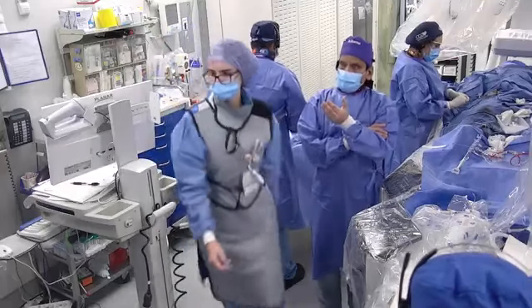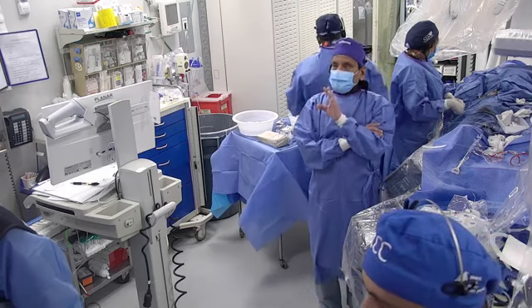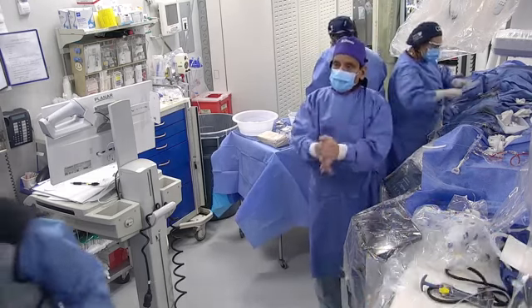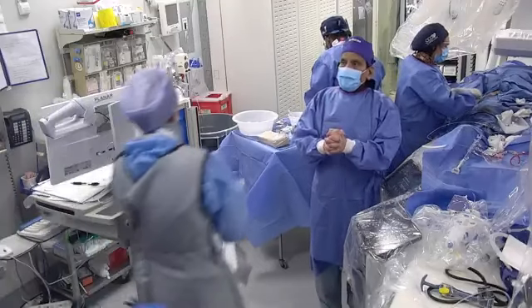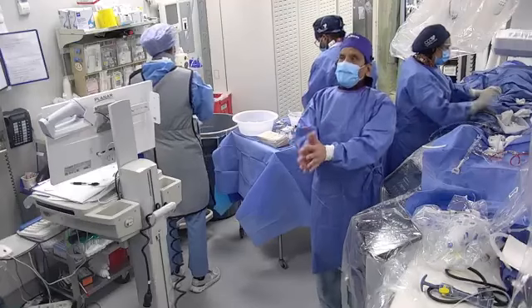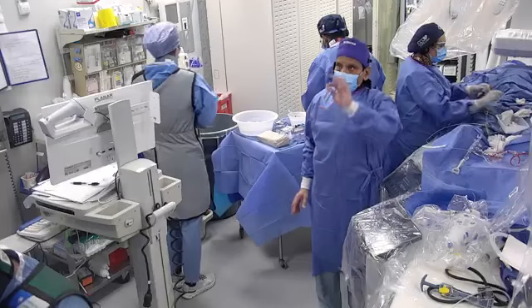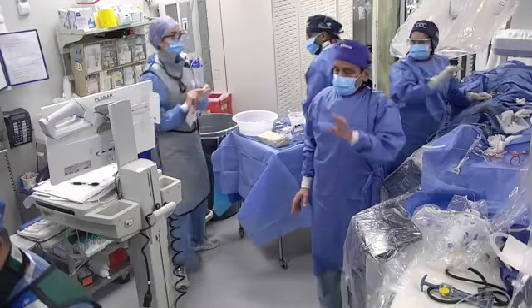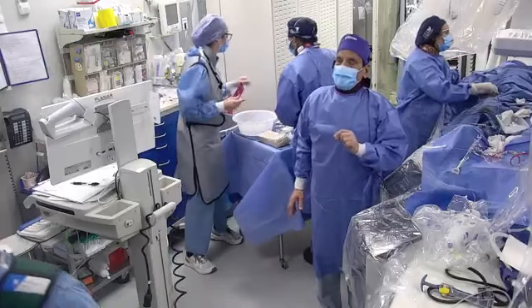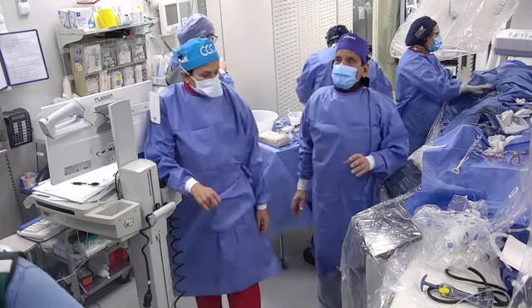I was one of the moderators, and I said, guys, whatever technique you use, you should use some support device, maybe a balloon pump. It's not that you need Impella. But then they said, okay, we are going with IVL. I said, what? IVL in this case with the RCA closed and ejection fraction 30%? This patient will be in hemodynamic trouble. You may do a quick rota, get a lumen, then use IVL. And guess what happened? In their first IVL, within the third pulse, blood pressure became 30. Urgently, they had to put a balloon pump in that case.